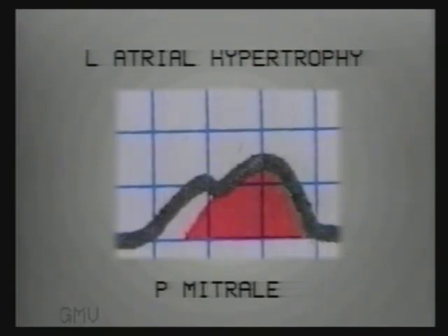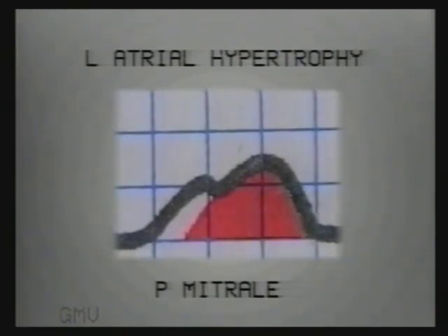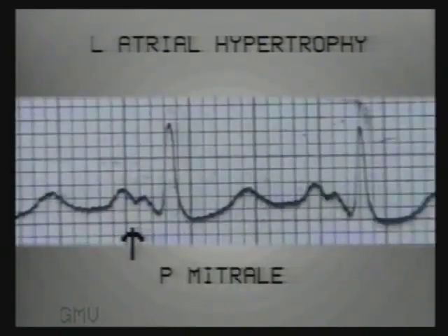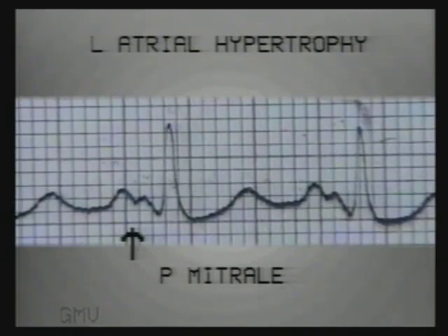In left atrial hypertrophy, the second component is delayed and prominent, giving a wide and notched P wave wider than 2.5 small squares. Since this is common in mitral valve diseases, it is termed P mitrale. Note the P mitrale: notched and 3.5 small squares wide — width more than 2.5 squares is the main criterion.